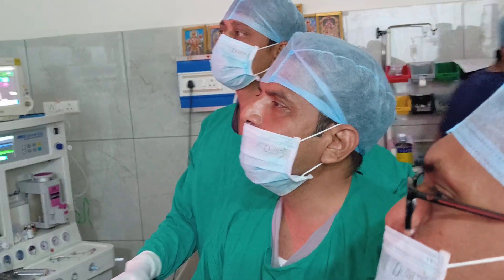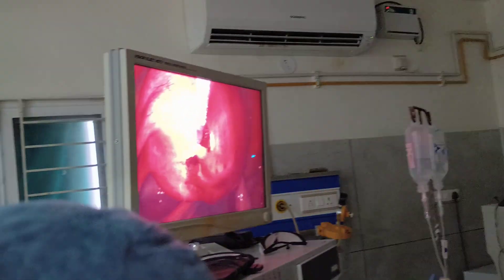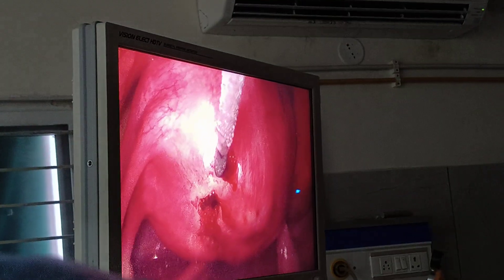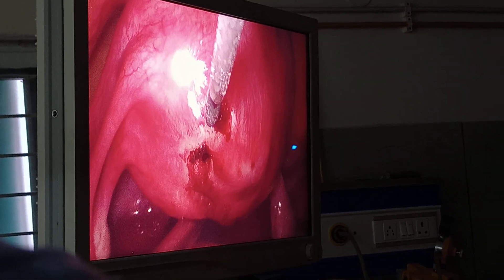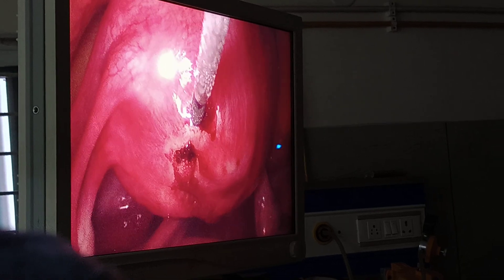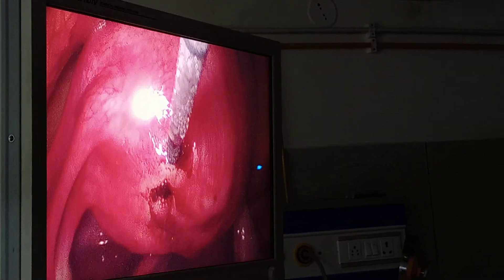You can see the first puncture was bleeding. So we have taken another puncture above. Now you can see there is steaming inside — the heat and the bubbling in the first puncture. You can see the water bubbling coming out. Blood is stopping, there is water coming out.